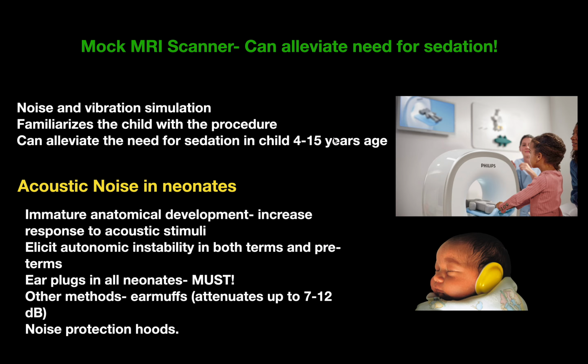Now, I told you about the mock MRI scanner. A mock MRI scanner can reduce the need for sedation. It gives a simulation of noise and vibration, familiarizes the children with the procedure, and can reduce the need for sedation in children from 4 to 15 years of age.